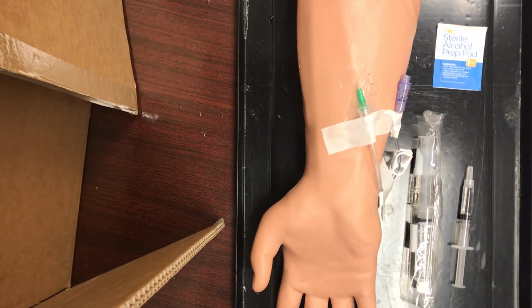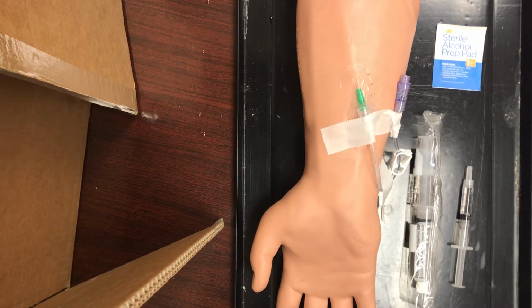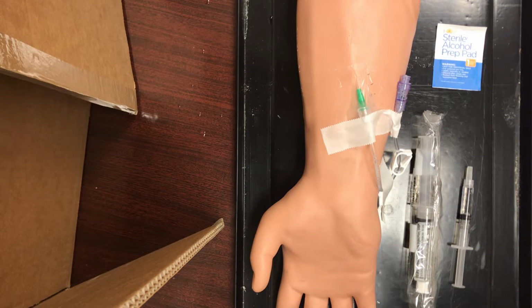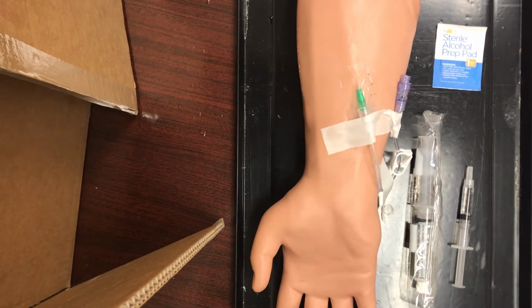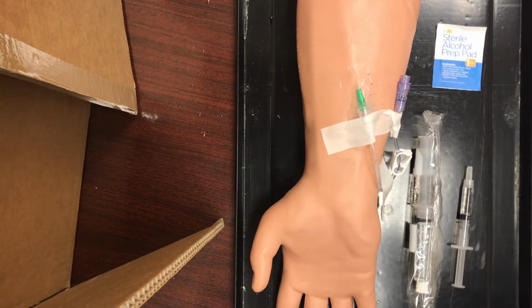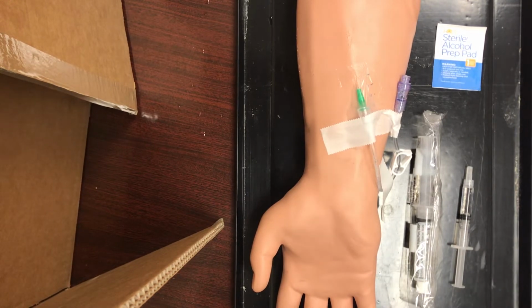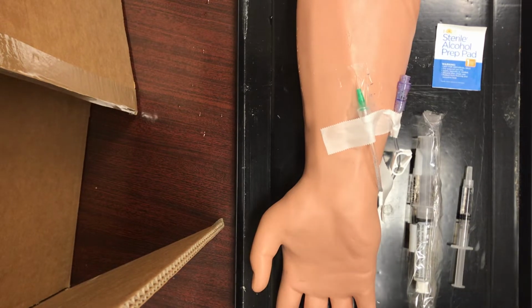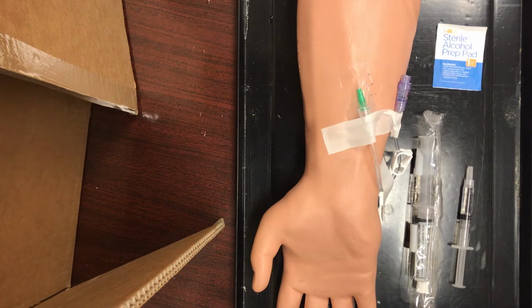The first thing we like to look at typically would be the drug, so whatever specific medication it is. We're looking at the dose of the medication that we're giving. We want to look at the integrity of the container, the color, the clarity, the concentration of the medication. We also want to check the expiration date. So at this point, we're doing our first check. We want to make sure we've checked the 6 patient rights, which include the right patient, the right drug, the right dose, the right route, the right time, and the right documentation. Again, at this point, we're double checking allergies, asking the patient, and verifying that on their chart.